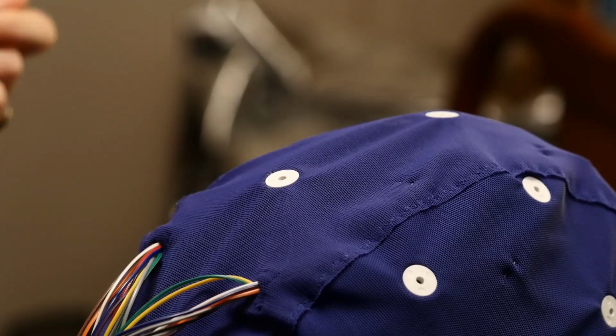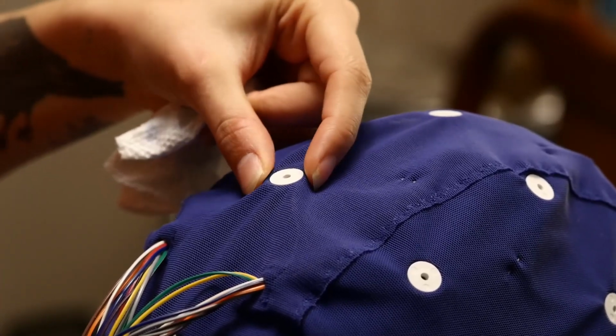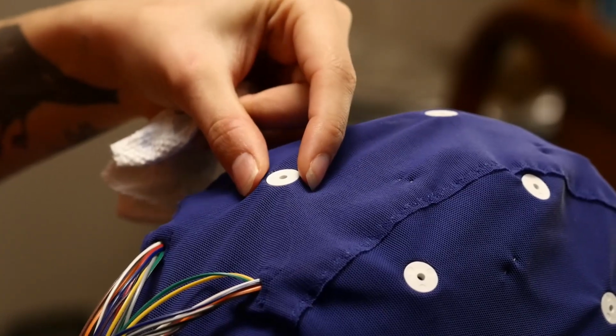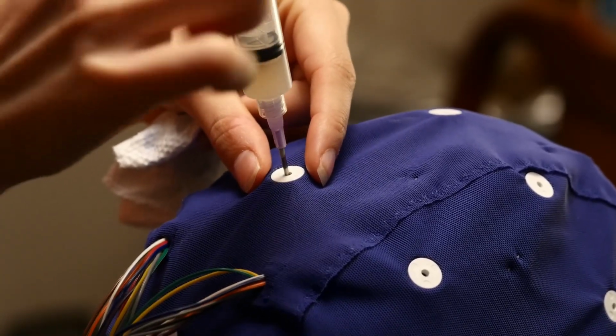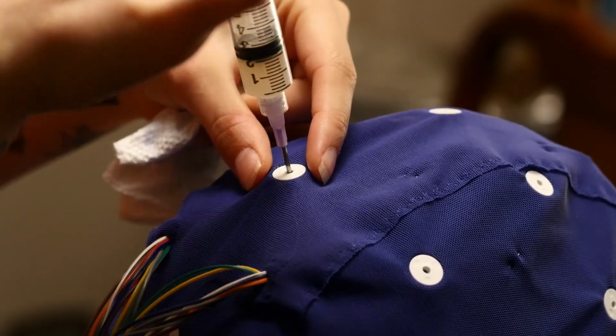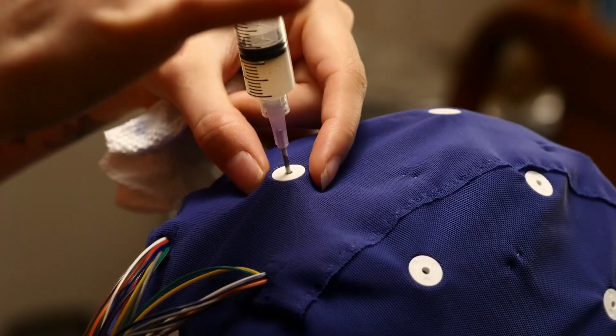All right, so here we have another angle, and we're going to go ahead and once again get a firm grip of our electrode, make sure we've got it in hand, and we're going to do the same thing. We're going to lift our electrode and our syringe away from the scalp. Notice no pressure is being put on the syringe.